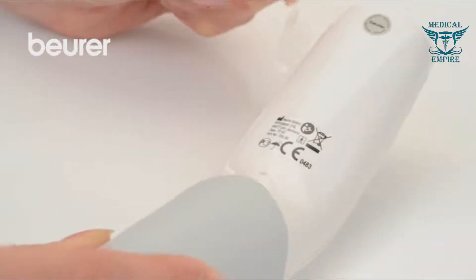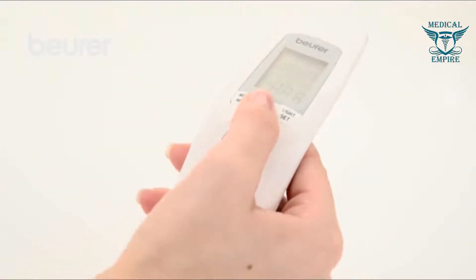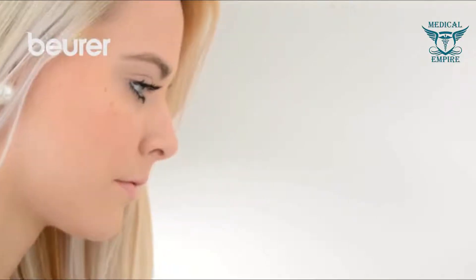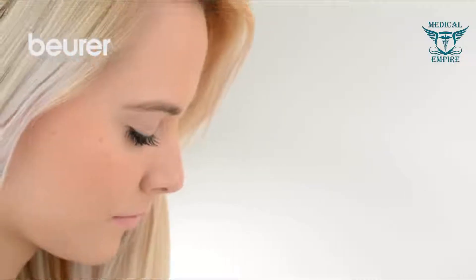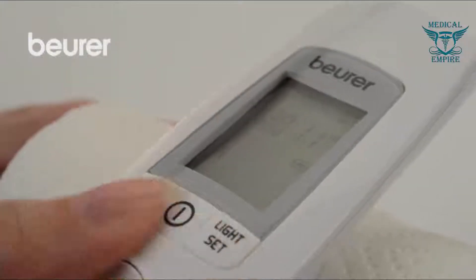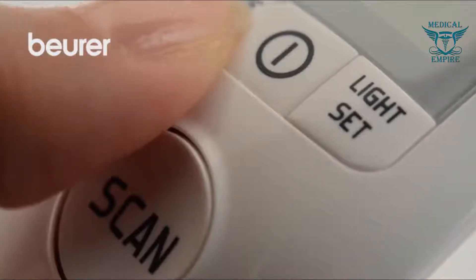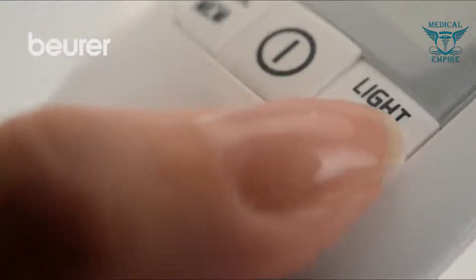Remove the battery insulation strip. The full screen view opens and you hear two short beeps. Press and hold the light set button for 5 seconds. The time format display flashes. Use the mode MEM button to set the time format and confirm with the light set button.